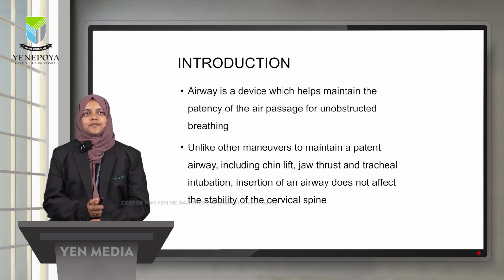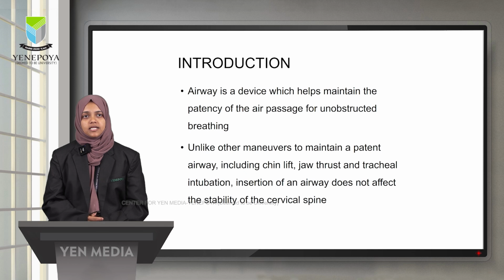So what is an airway? An airway is a device which helps to maintain the patency of air passage for unobstructed breathing or easy breathing. Unlike other maneuvers to maintain a patent airway, including chin lift, jaw thrust, and tracheal intubation, insertion of an airway does not affect the stability of the cervical spine.